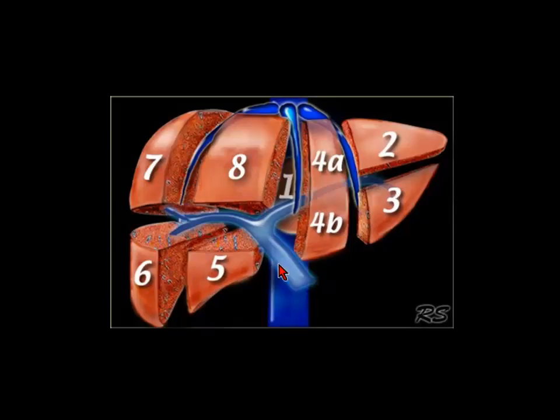The landmarks, how you describe them, that's the portal vein coming through, dividing into the right and left, the right anterior and posterior, and then the hepatic veins coming down, left, middle and right. Okay, let's start from here. So you come down to the portal vein, then once you have identified the portal vein, you start cranially. Either you start cranially or caudally. So let's start cranially, above.